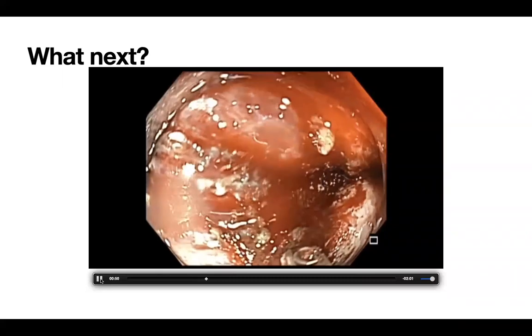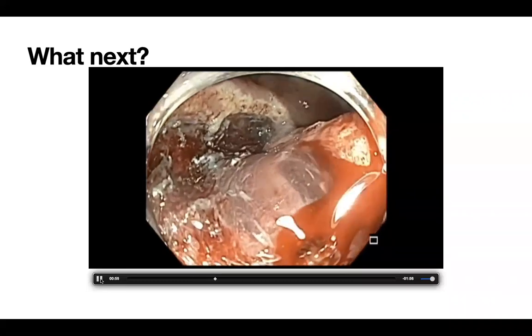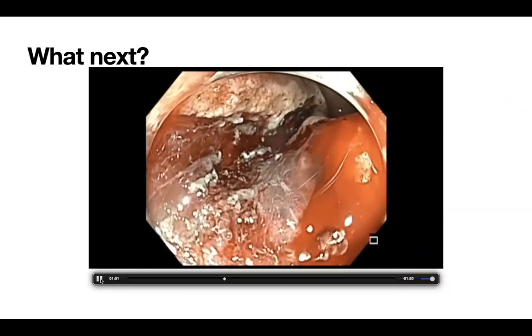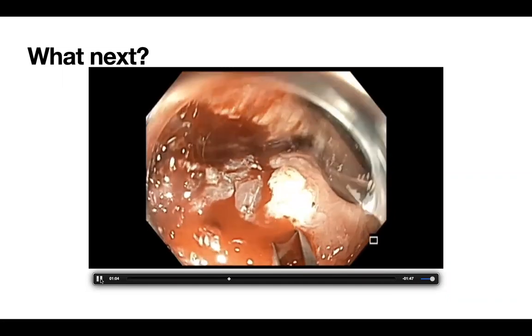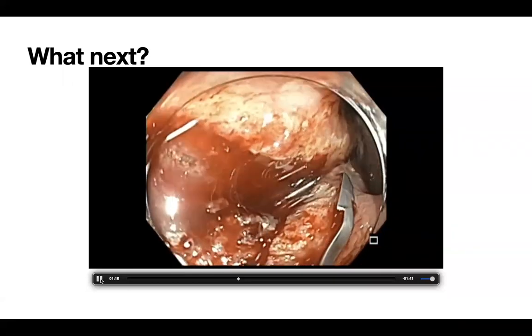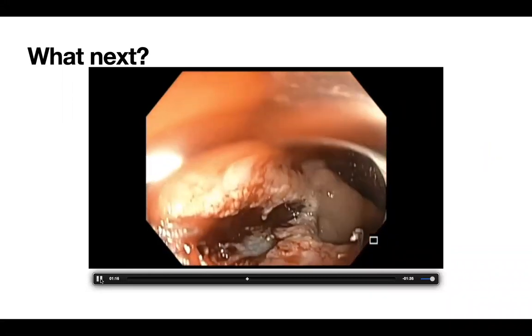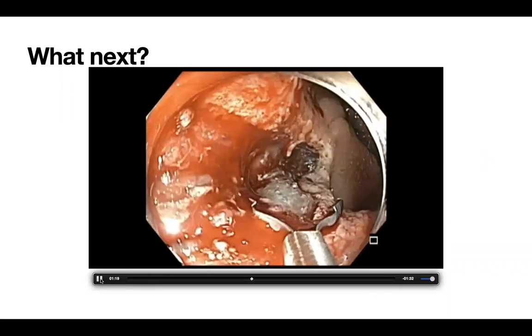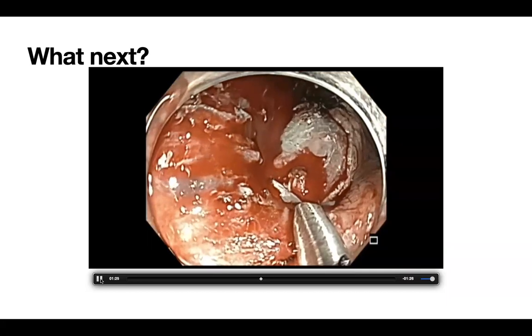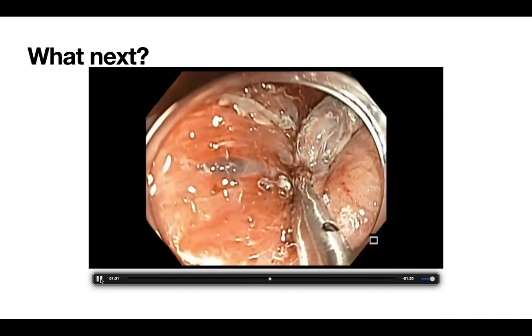What happened was, accidentally I pressed the yellow pedal. Yellow pedal is a cut current, right? And instead of coagulation, it basically cut that vessel. And I could not coagulate, although I tried to coagulate. And then I felt that the best thing is to apply tamponade with a clip. This is something that I've tried before, where you could actually get the vessel nice and go deep with your clip. And as you can see here, we're able to basically apply some tamponade.